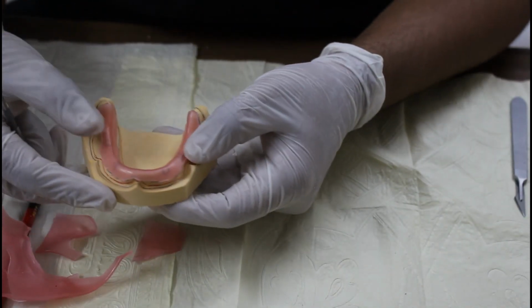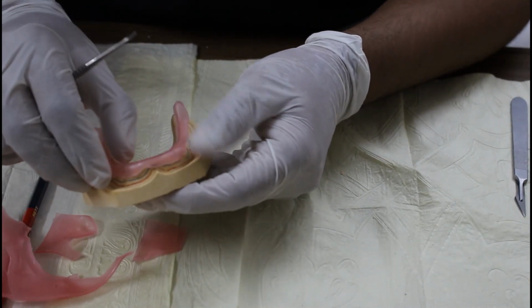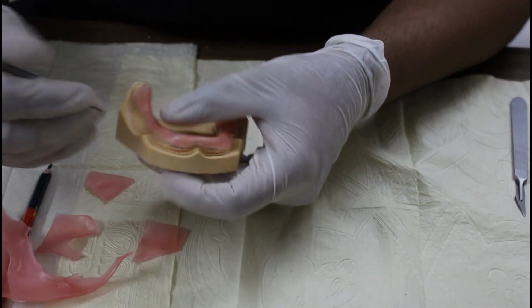This is your spacer. Okay, keep it here back, and now cut the tissue stops.